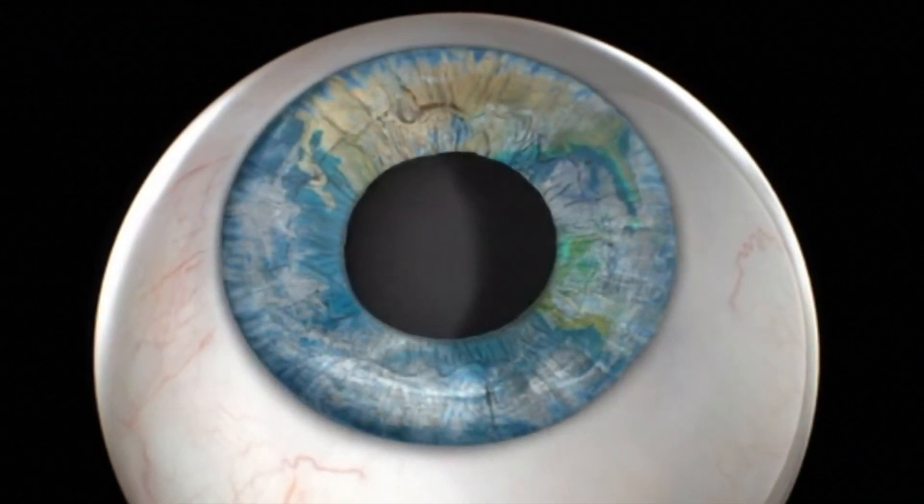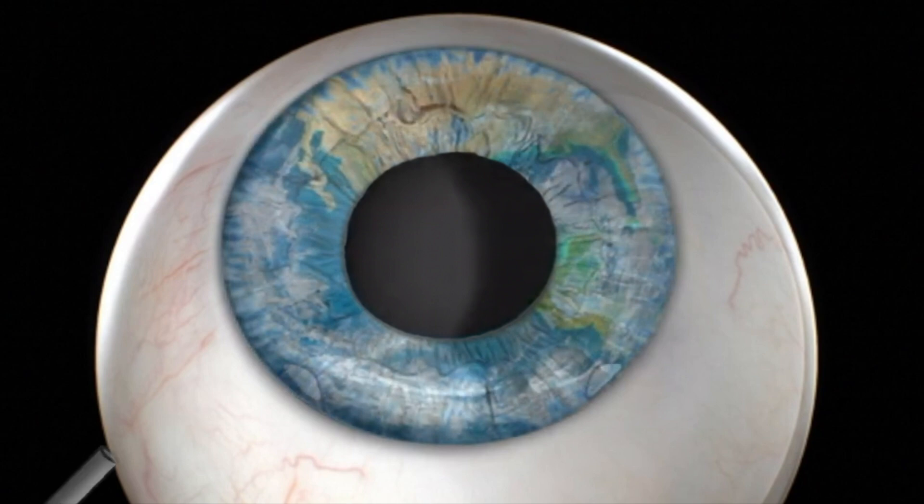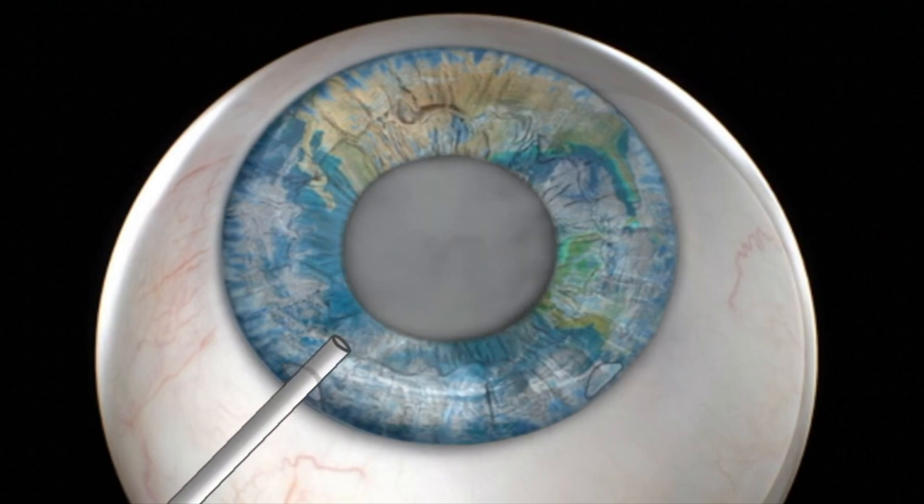After the eye is dilated, two or more incisions are made in the cornea periphery. Medication is injected into the eye to prepare the lens for surgical removal.